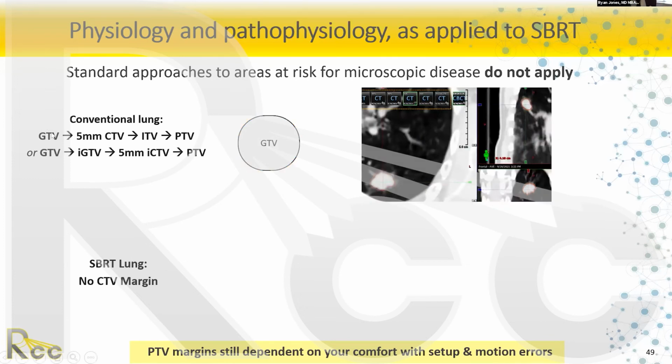Some will, as we do nowadays, if we have 4D CT imaging available, the method I think the AAPM endorsed is you first do your CTV expansion, then you account for motion. Then you put your planning target volume margin.